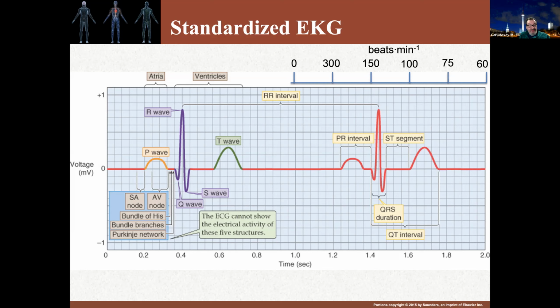The Q wave is the first negative deflection on the tracing in this lead here. And it's then followed by an R wave, which is a positive deflection. So here's our negative Q, our positive R. And finally by an S wave, which again has a negative deflection.